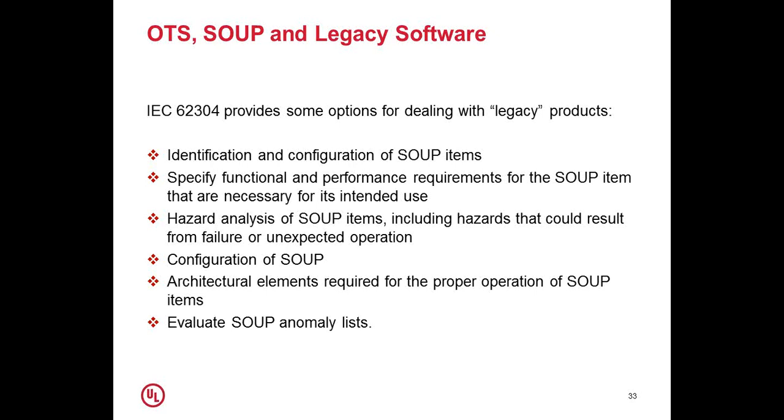Configuration of SOUP, how you configure them, how you use them, architectural elements required for the proper operation of SOUP items. You may also need to evaluate the SOUP anomalies list. Many times, the software manufacturer would also give you the list of anomalies, which could be handy for your risk analysis and management of the software.